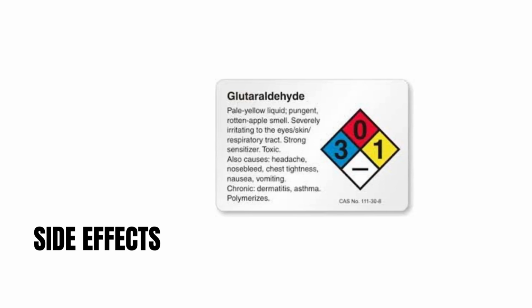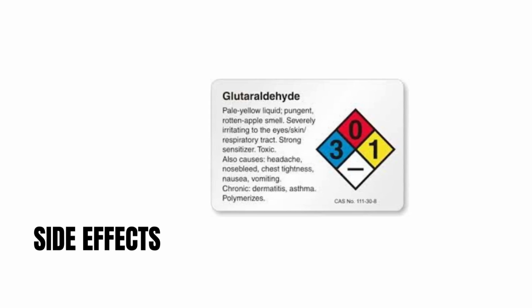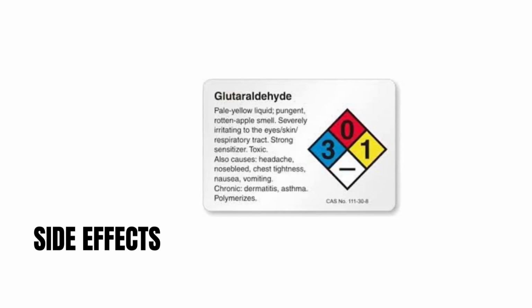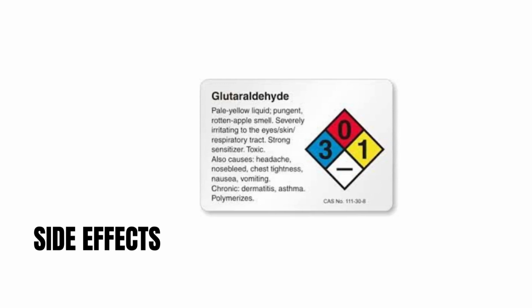Most of the side effects of glutaraldehyde are breathlessness, rhinitis, eye irritation, and dermatitis. You can find a link to a video giving the details about the health hazards of glutaraldehyde use.